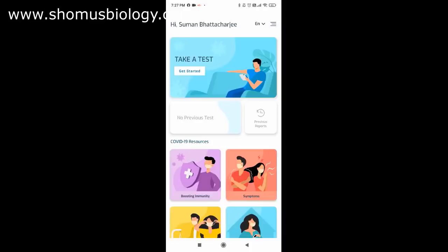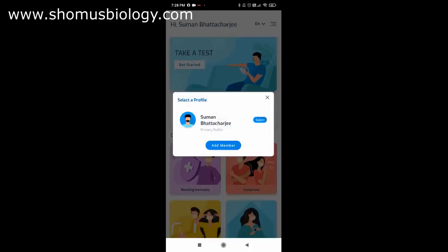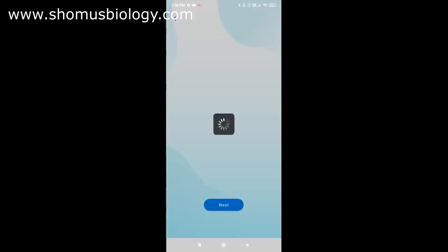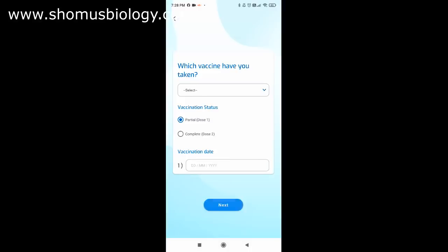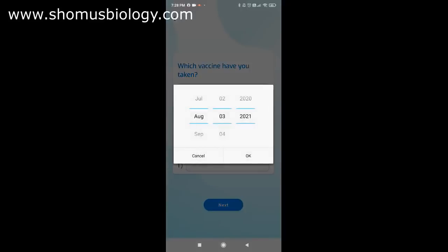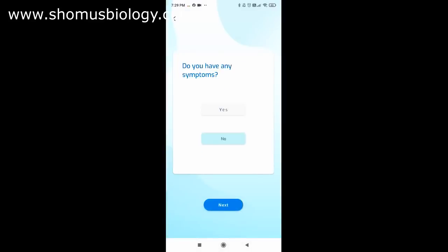Once logged in, click 'Allow' and select 'Take a Test' then 'Get Started.' Enter your name, add members if needed, and select yourself. It asks whether you've taken the COVID-19 vaccine — select yes and choose your vaccine. I took Covishield, a partial dose, around July 20. Then it asks whether you have any symptoms — I selected no.